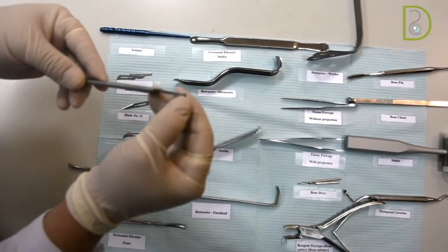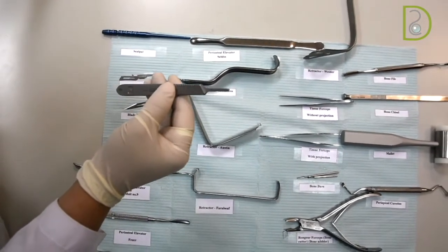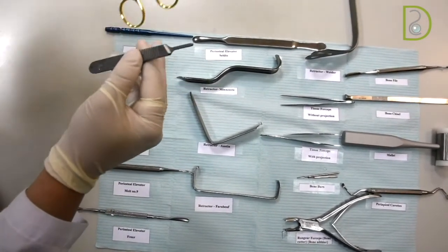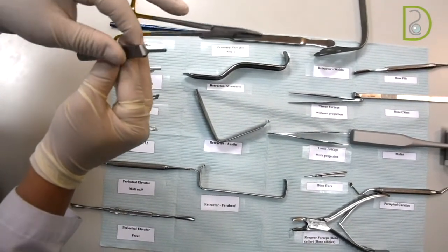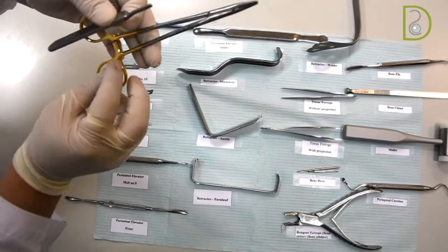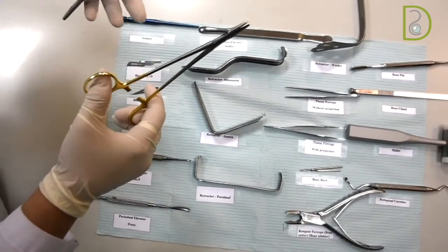And how we will do it is using a needle holder or artery forceps. You can use whatever instrument that you can lock and unlock so you can safely handle the blade during this time.